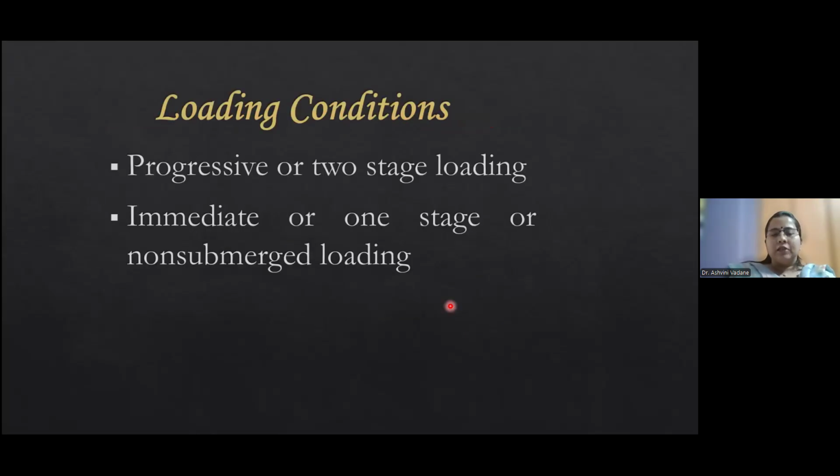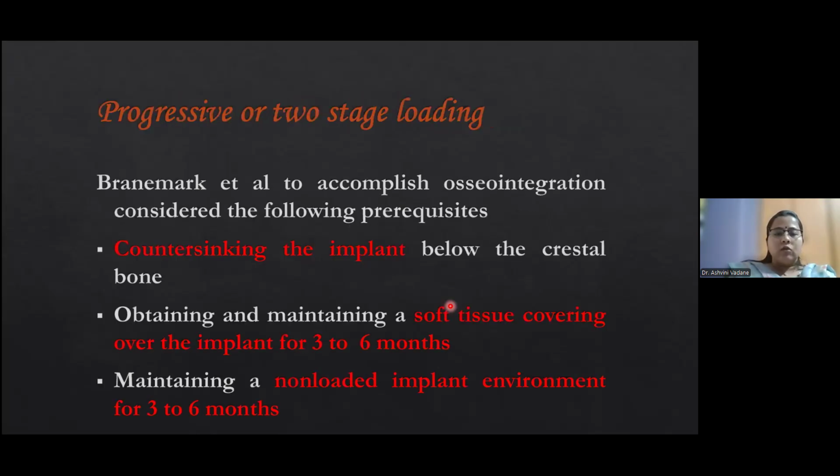Regarding the loading conditions to achieve good osseointegration, there is the progressive or two-stage loading, and second is the immediate or one-stage or non-submerged loading. Progressive or two-stage loading, Branemark et al. To accomplish osseointegration, consider the following prerequisite: countersinking the implant below the crestal bone.